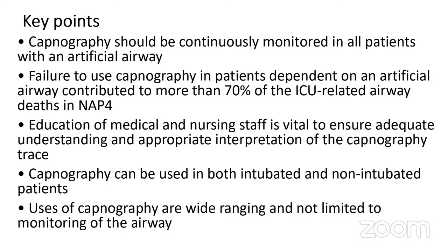Education of the medical and the nursing staff is also vital to ensure adequate understanding and the appropriate interpretation of the capnography trace. Capnography can be used in both intubated and non-intubated patients, and its uses are a wide range, not only limited to the monitoring of the airway.